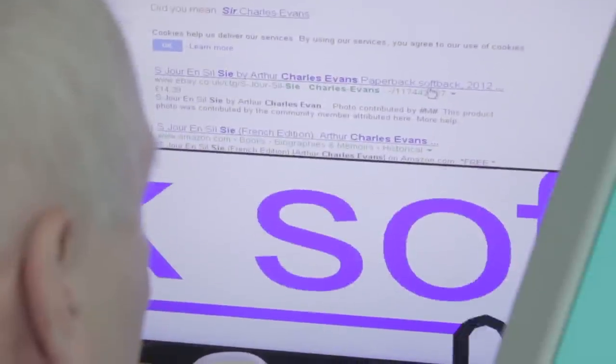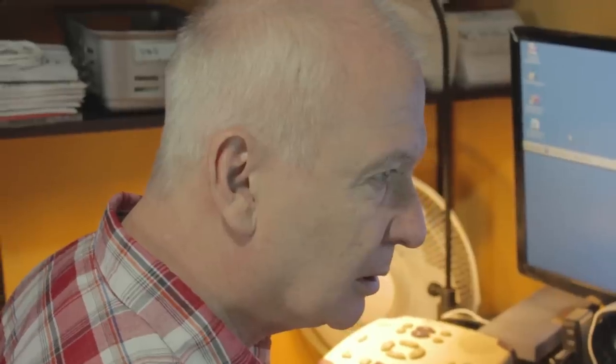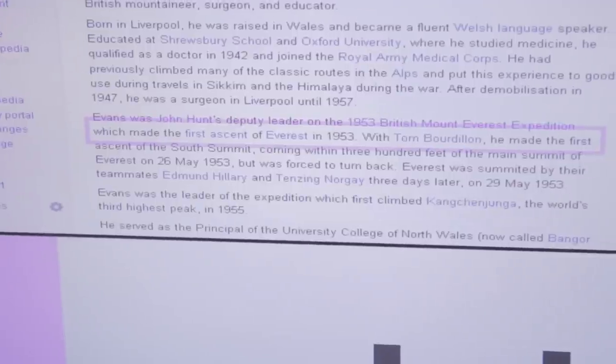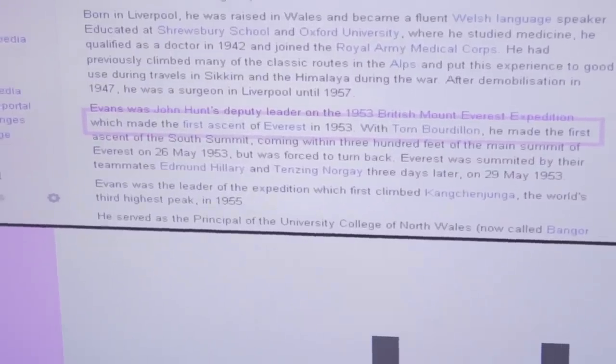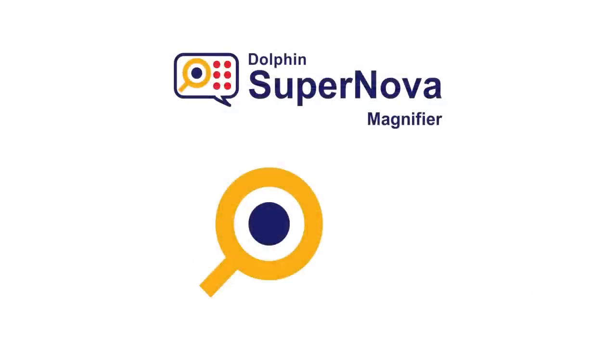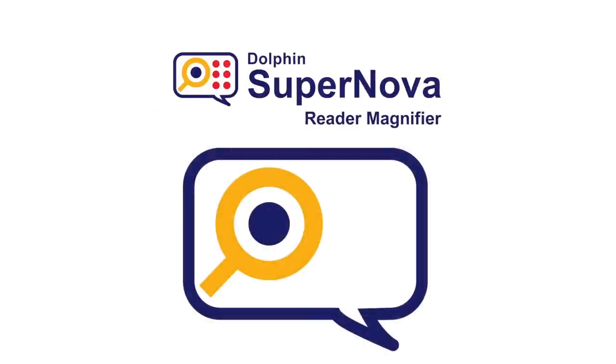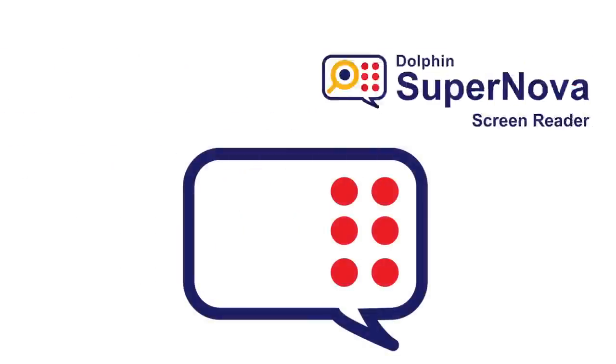I get the cursor into the spot where I can just about see the ingredients and then I might use either speech or just the magnification. If your sight changes, transfer your skills between Supernova editions.